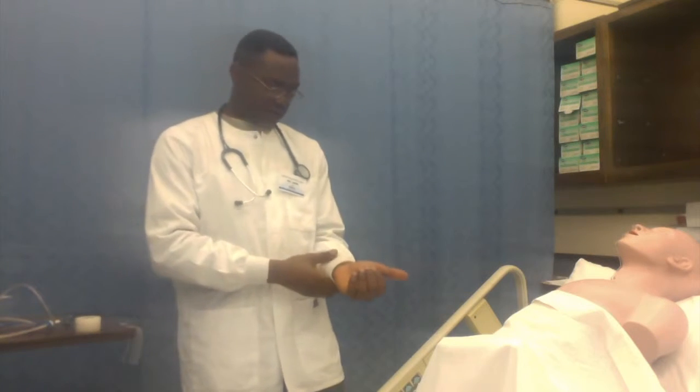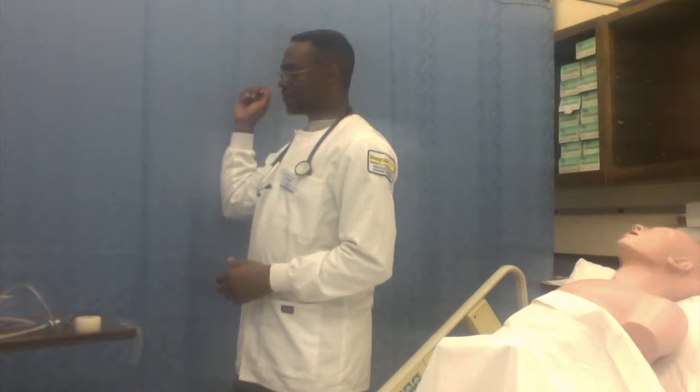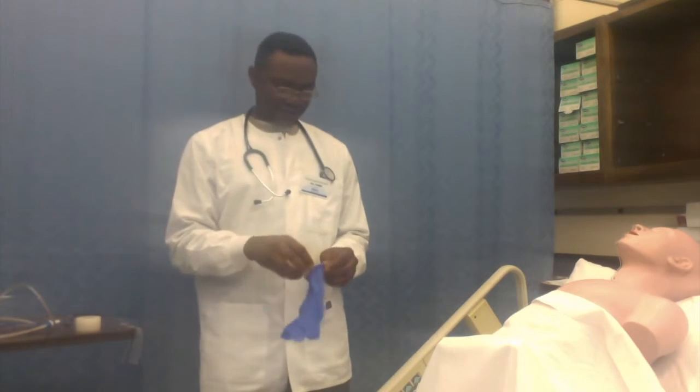I will now get to the patient's room, knock at the door and get in and introduce myself to the patient and also ask the patient to tell me his name and his date of birth. I will confirm his identity by looking at his wristband. Having done this, I will now provide for privacy, don my gloves, and assess the patient.